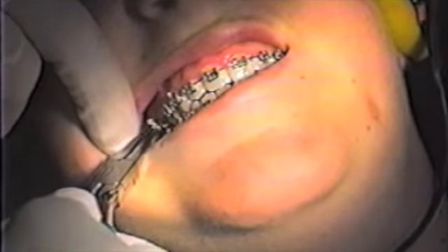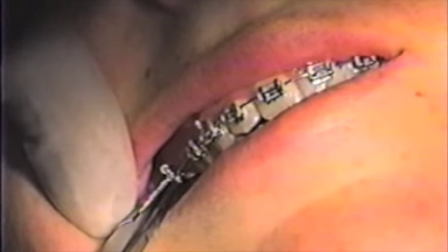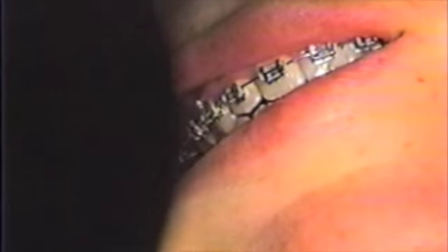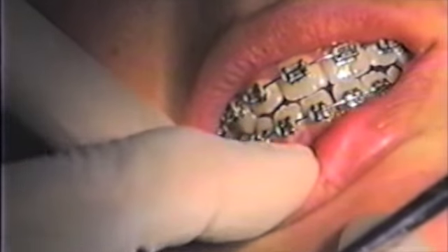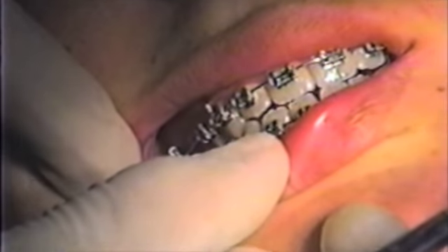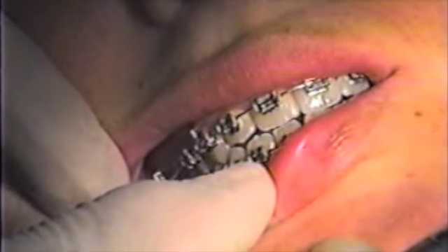Typically you will not have the wire and the coil when you purchase the safe spring on either end. Instead, you will use an 012 Kobayashi hook wire to attach to the molar and the cuspid brackets.